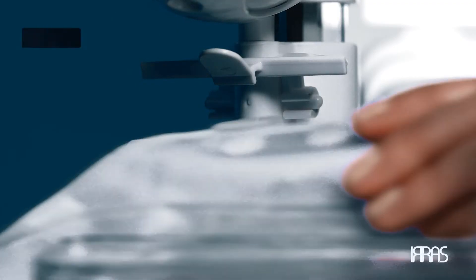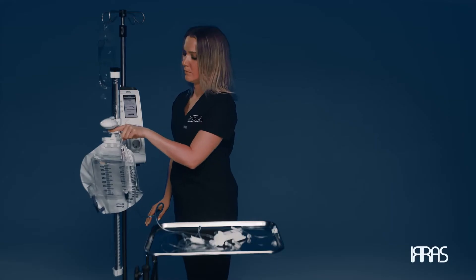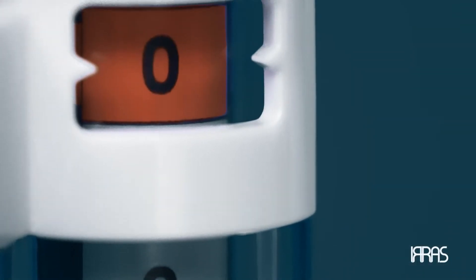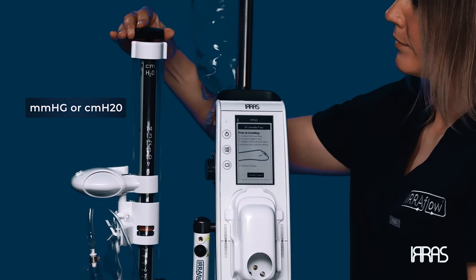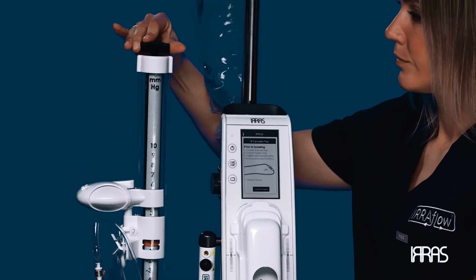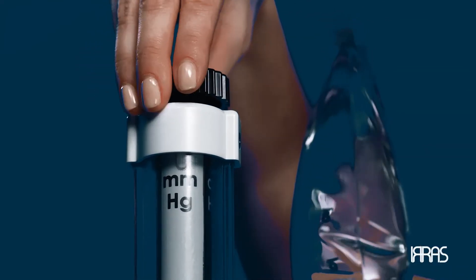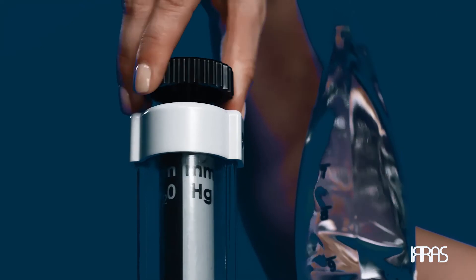You will hear the drainage collection system lock into place. Attach the drainage bag onto the hanger and lock it into place by closing the locking lever. Select your desired measuring scale — you can choose between millimeters of mercury or centimeters of water based on facility or physician preference. Turn the black knob at the top of the drainage collection system until your desired measuring scale is selected.